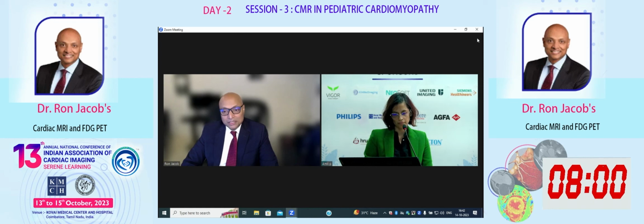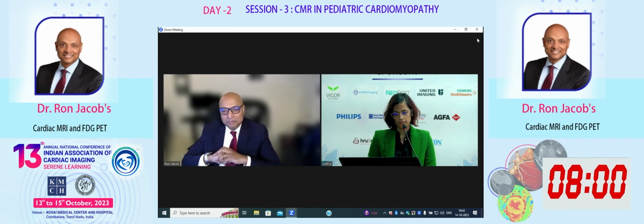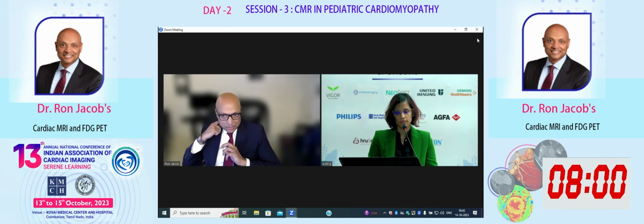Your FDG uptake, your dietary prep is good, and you're adequately suppressed, because we're seeing more and more the non-specific basal ring pattern, for example, the lateral wall uptake, and there are certain patterns that we see. It's not clear to me why some people are unable to suppress the FDG even with adequate dietary prep.